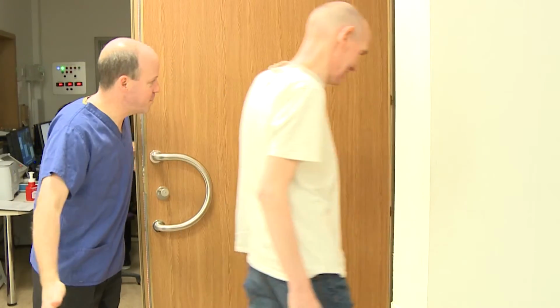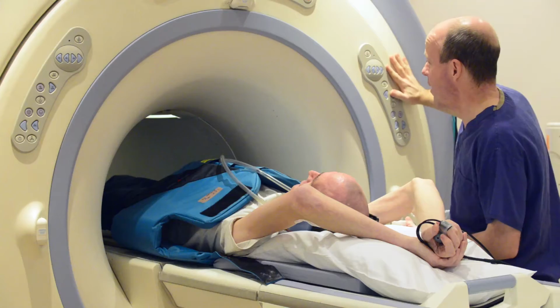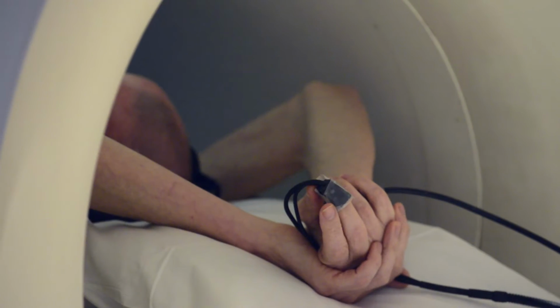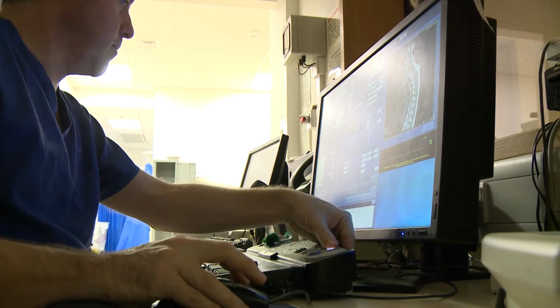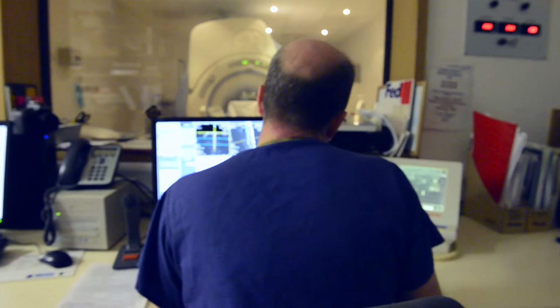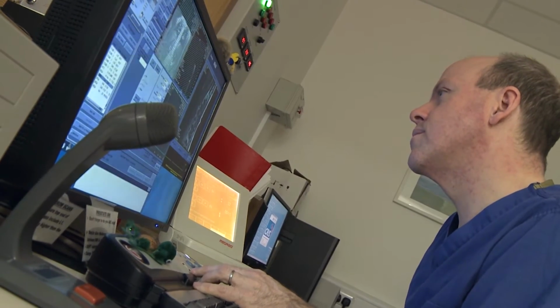So in the afternoon there are usually 3 MRI scans in total, and those are to look at different aspects of how the lungs are working. So the first scan looks at just airflow within the lungs. The second scan will look at how the gas is moving, and that can show us where the disease is. And then the last scan is a new scan that we're just looking at the airflow but in more detail. So seeing if any areas that potentially when you first look at them don't work, actually do work, you just need to give them a bit of time.